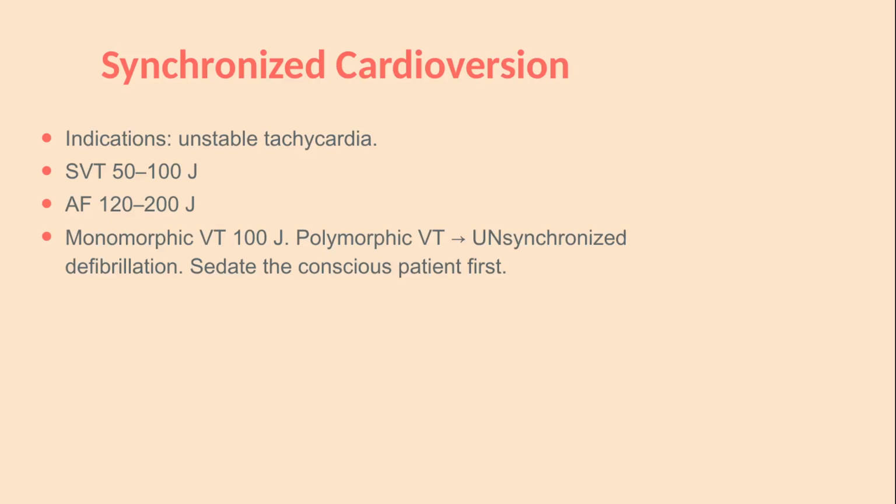Synchronized cardioversion is the treatment for unstable tachycardia with a pulse, and the word synchronized is doing real work. The machine times the shock to the R wave, avoiding the vulnerable period of the T wave, where an unsynchronized shock can induce ventricular fibrillation. Press the sync button, confirm the markers are landing on each R wave, and remember that many machines drop out of sync mode after every shock, so recheck before each attempt.